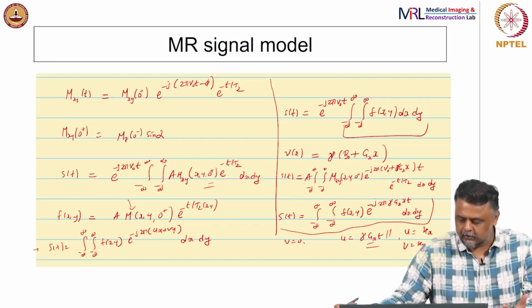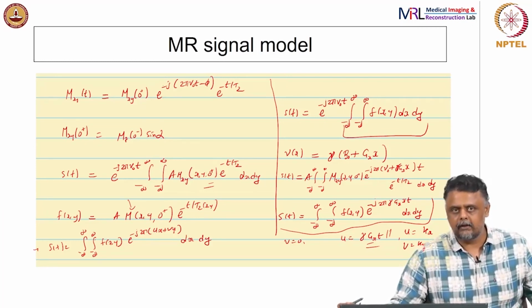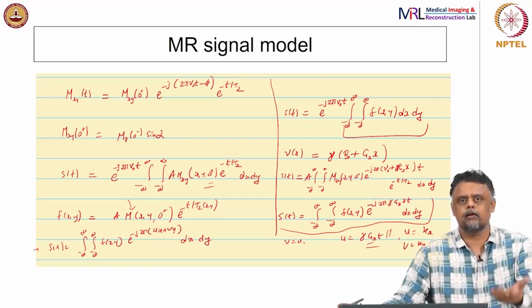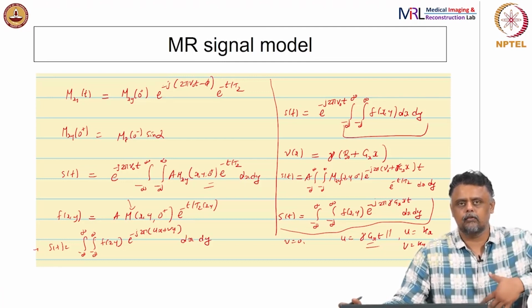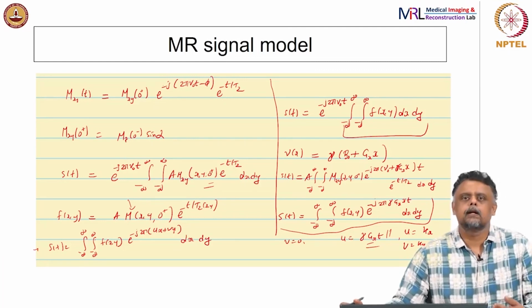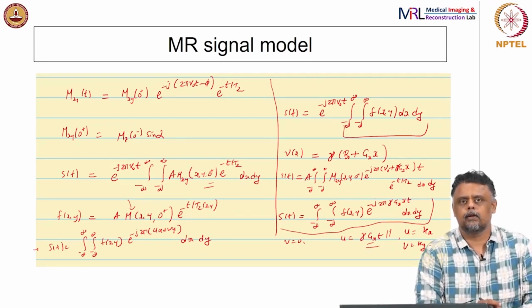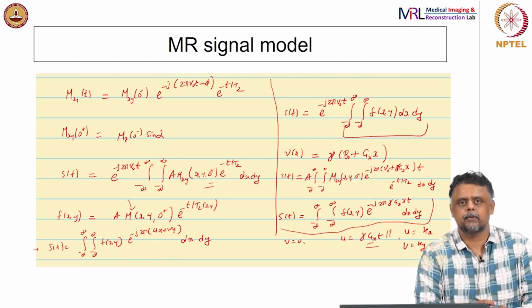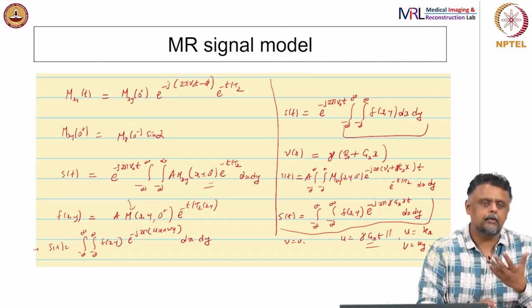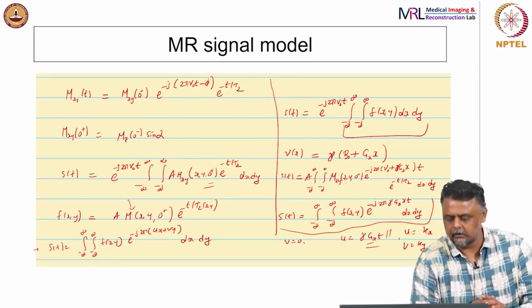And the way to actually measure would be to scan the so called K space, right, by taking on a range of frequencies. And how do you adjust that? By changing your gradient, correct. That is one way of doing it, or the most effective way of doing it, is changing the gradient. By changing the gradient, you will capture a variety of kx and ky, and therefore, that will give rise to your Fourier transform, that is a k space acquisition, and using that you can reconstruct your image. Okay. That is the interpretation of image acquisition in an NMR signal, in an MR system. Okay.